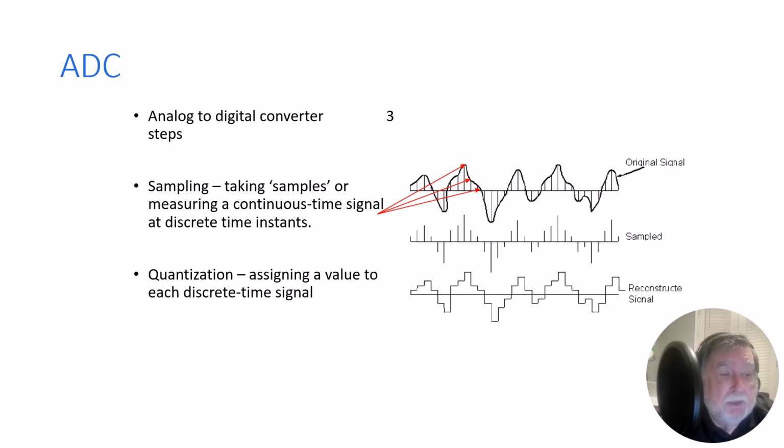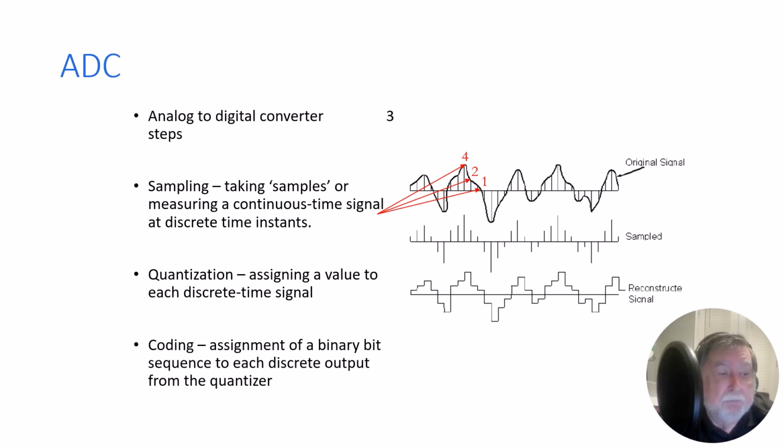When we've measured them, what we have to do is assign a number to them. In other words, we digitize them. That is the analog continuous signal now being changed into a discrete number. Here we can see the different intensities at different times are changed to discrete numbers.